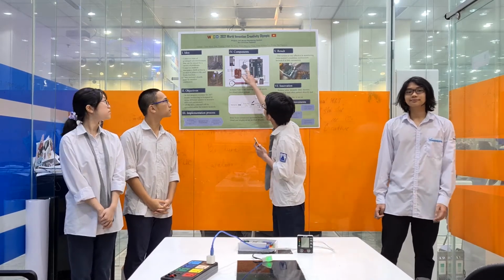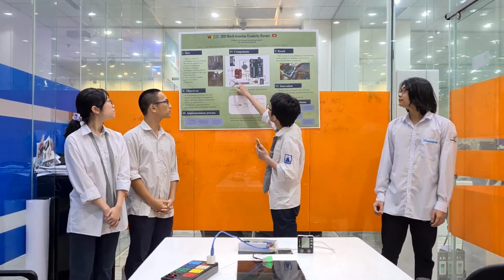Our system has 3 sensors: the blood pressure sensor, the ECG sensor, and the ambient temperature sensor. These 3 sensors are connected to a central processing microcontroller. In this case, it's an Arduino Uno. This board can be easily programmed by software called the Arduino Integrated Development Environment. In our project, the Arduino Uno mainly functions as a data processor that takes in analog values from the sensors and converts them into Celsius degrees, beats per minute, and so on.